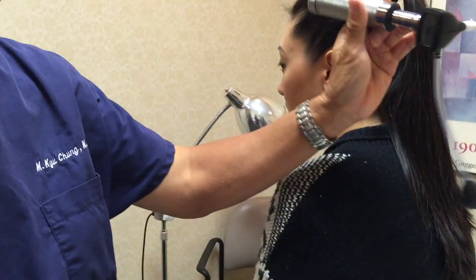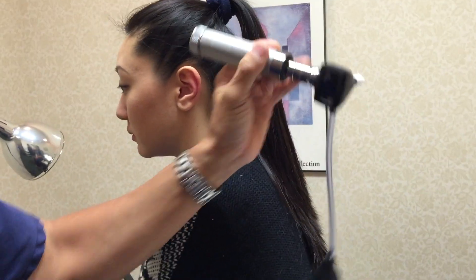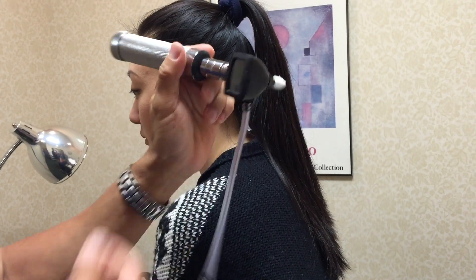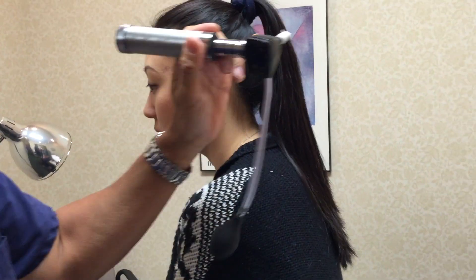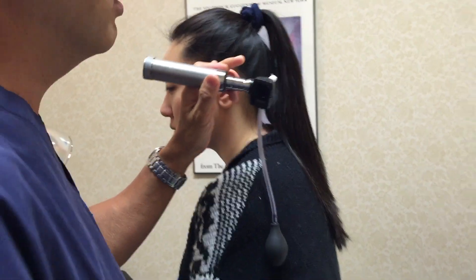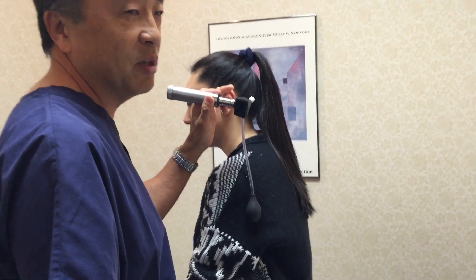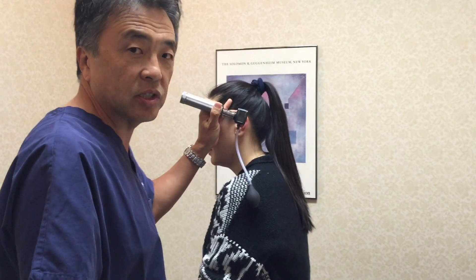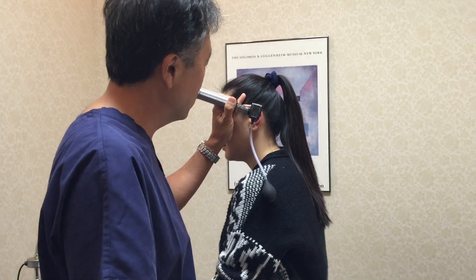This will fit right into the ear. I like to hold the scope like this — not like this — like this. This is a pet peeve of mine because one of the advantages of this — I guess it has to do with my old days when I used to play billiards — you can hold and keep things perfectly steady.